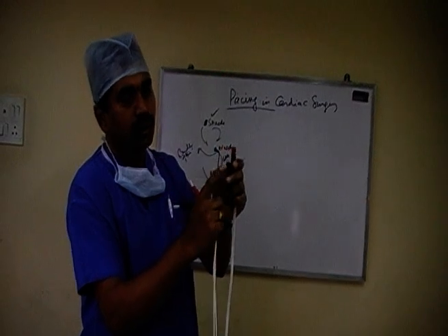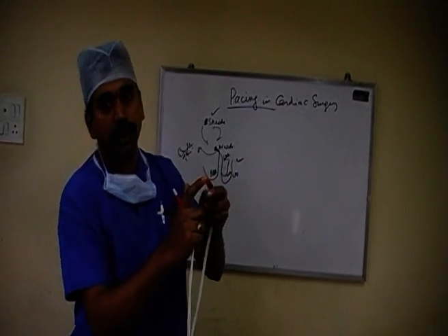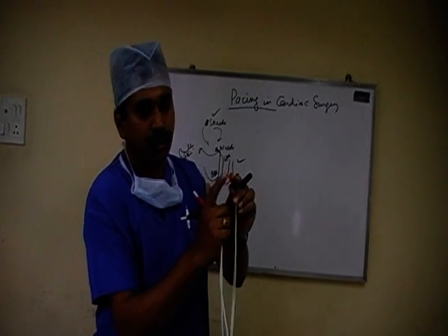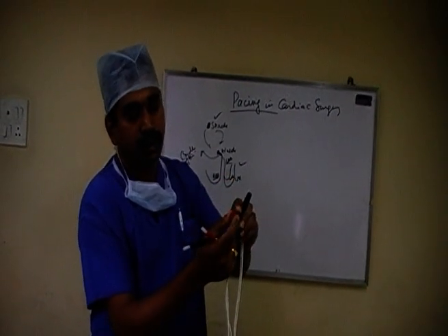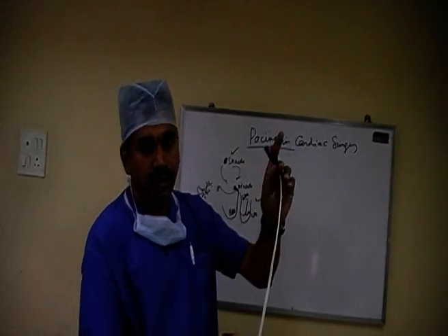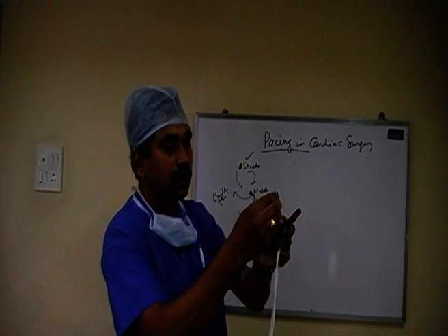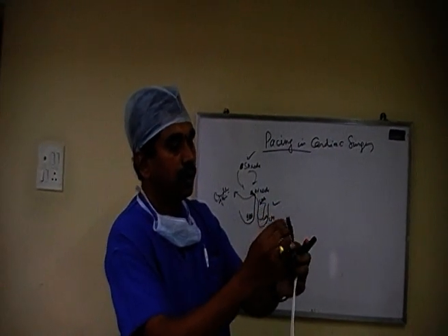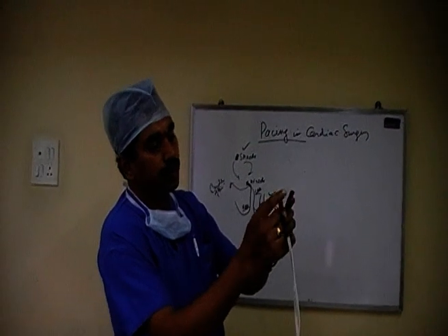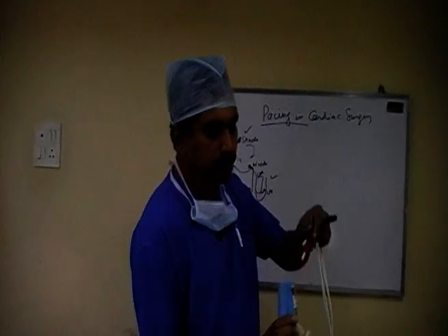If there is only one, you select the black one for the different lead, and then put a hypodermic needle and connect that to this one directly, so you can allow the needle to go into this hole and tighten it. Once this is tightened, the patient is connected to the lead, and the other end has got two needle ends which go into the pacing box.